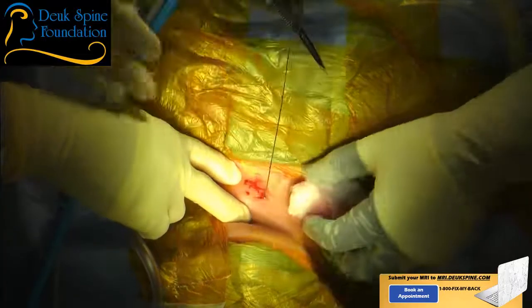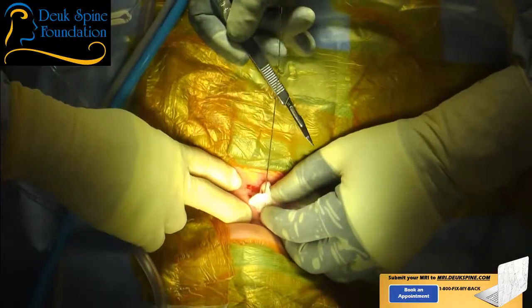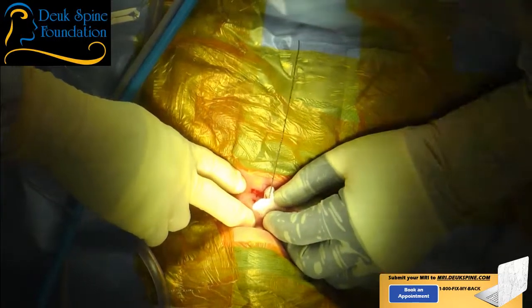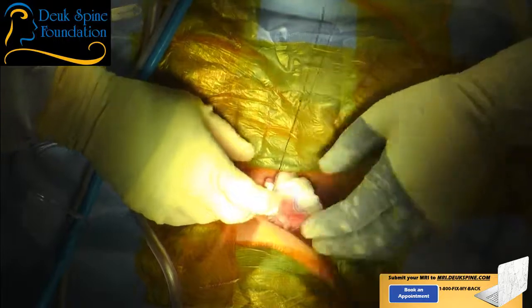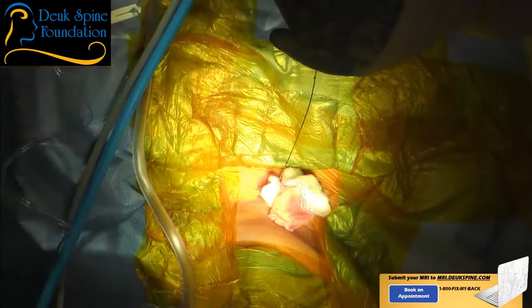Now, I'm making an incision in her neck. I'm using an 11 blade. Can you see that, Sean? Yes, we can. Now, how long is the incision? It's 4 millimeters. 4 millimeters. Wide enough to put in my tubular retractor to do her endoscopic surgery. We're going to go down with the dilator, right over the guide wire.